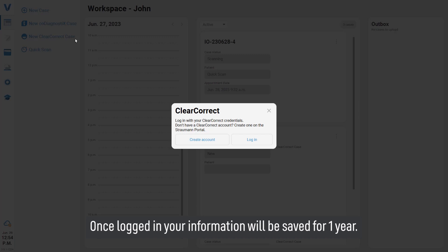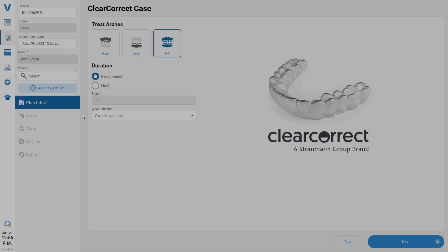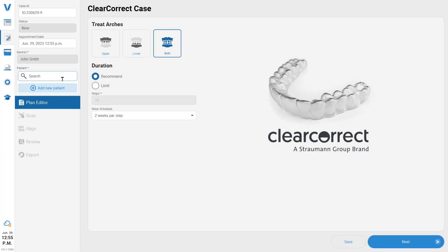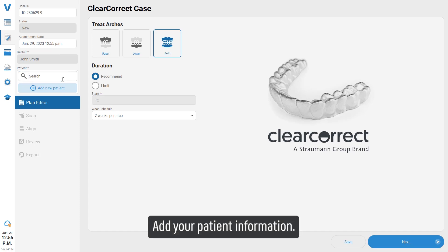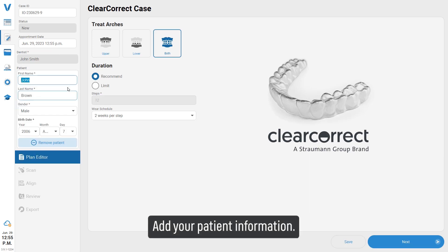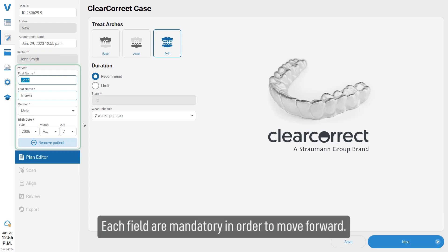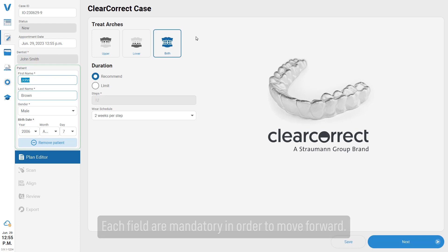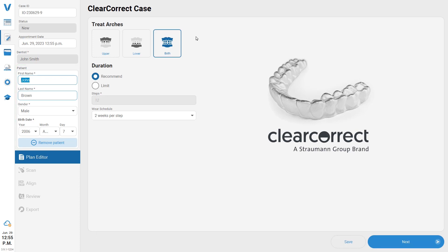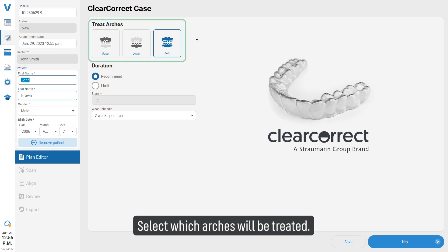Add your patient information. Each field is mandatory in order to move forward. Select which arches will be treated.